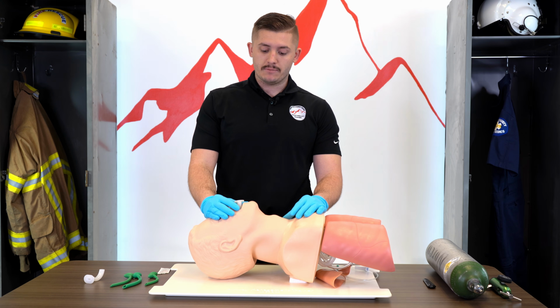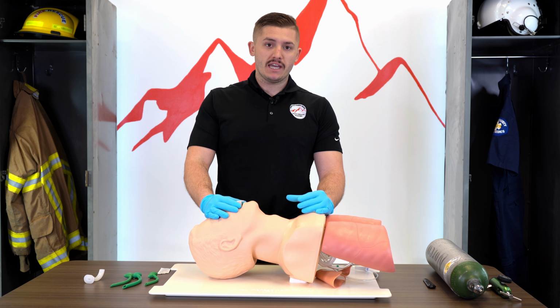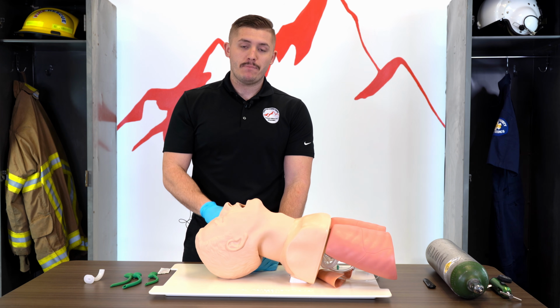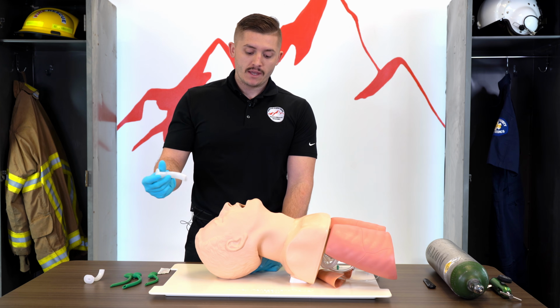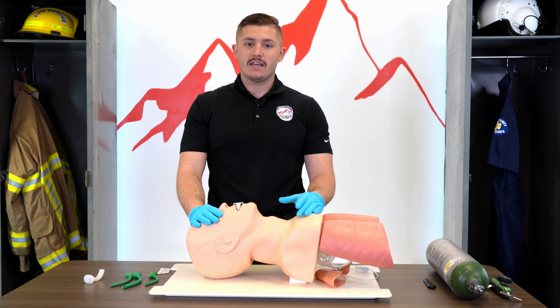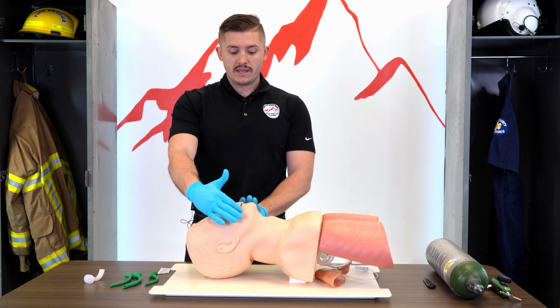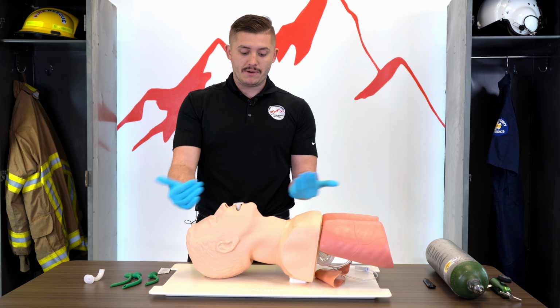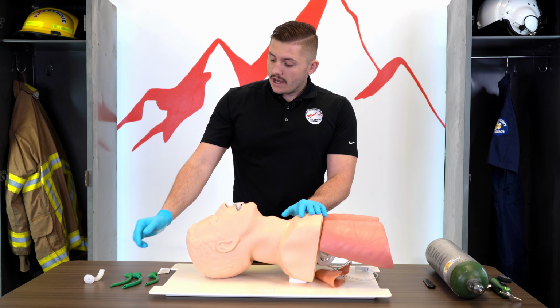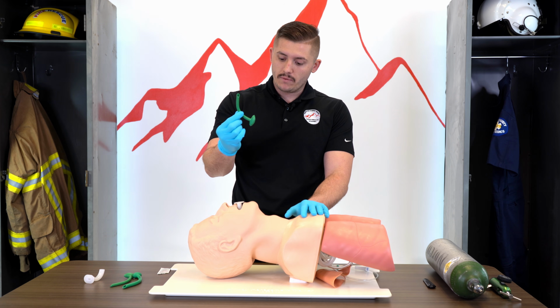Now my patient accepts. If my patient begins to gag or bites down on this OPA, I want to immediately take it out because I want to prevent my patient from vomiting, okay? But if not, we're good to just leave it in, and now we can start bagging our patient, and now this airway is protected, right? I have the tongue out of the way, the airway is open, they can't close it because my OPA is in the way, and I can start delivering breaths. The other thing we have is an NPA, or the nasopharyngeal airway.